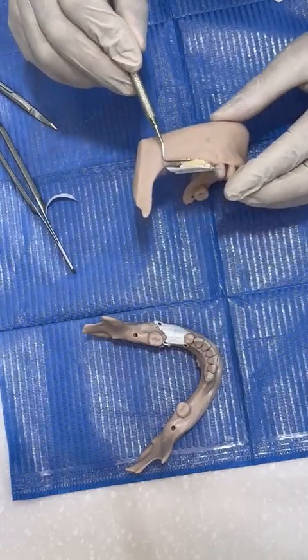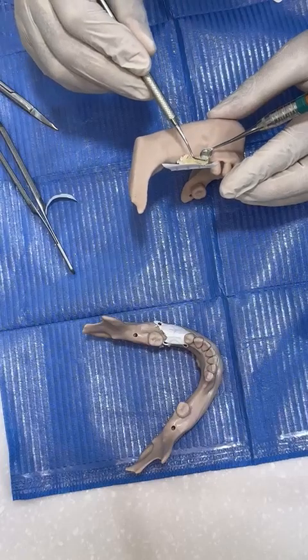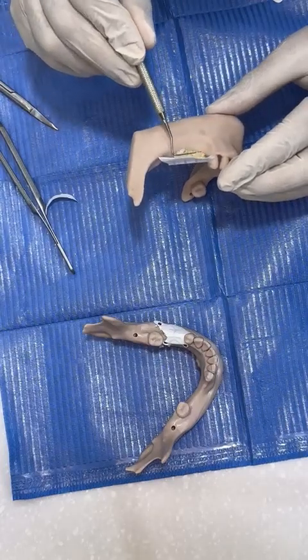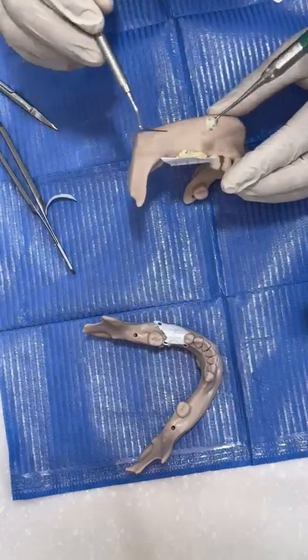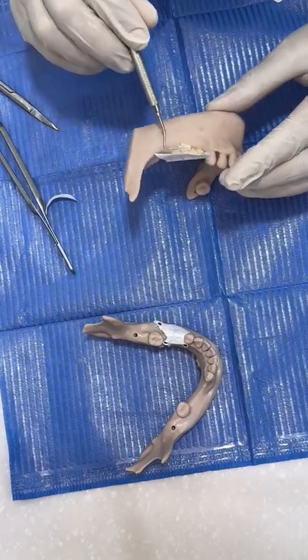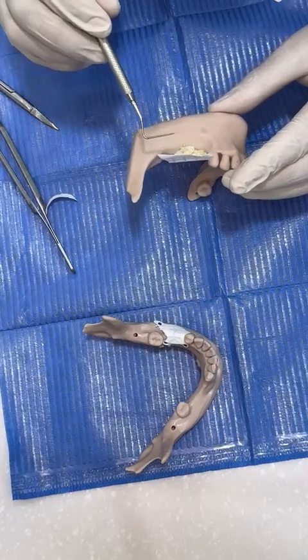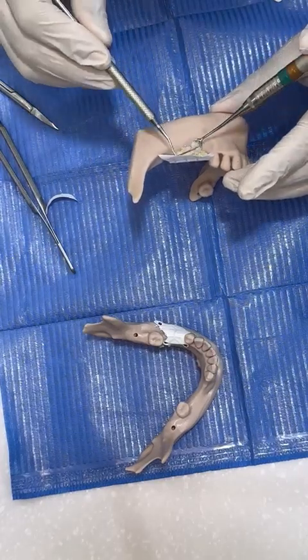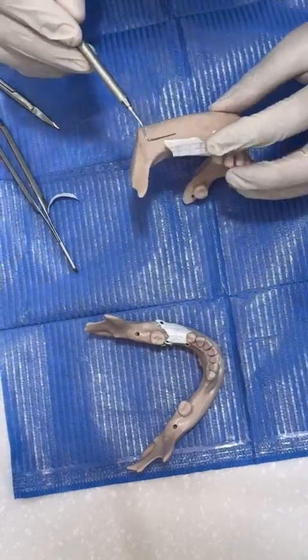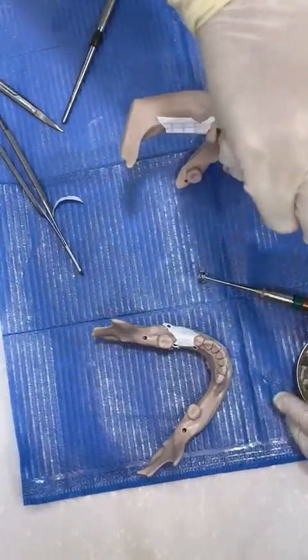More, please. Give me some more. Okay. Very good. Now you can mix more graft. Put more graft here.